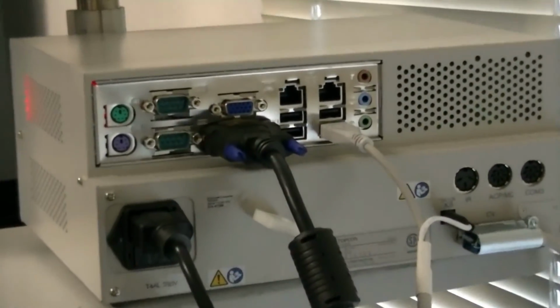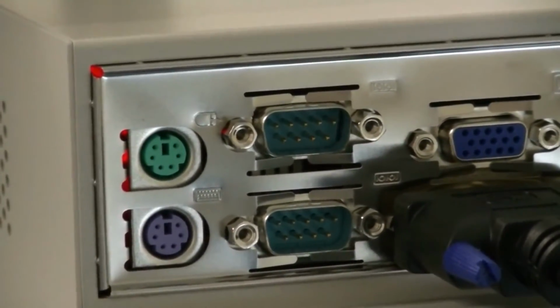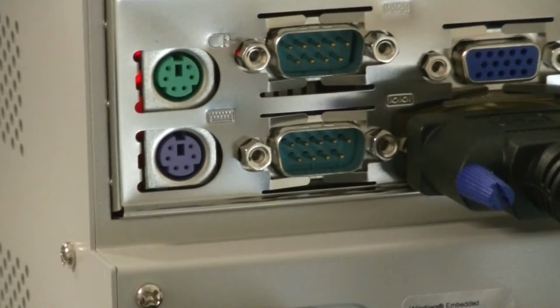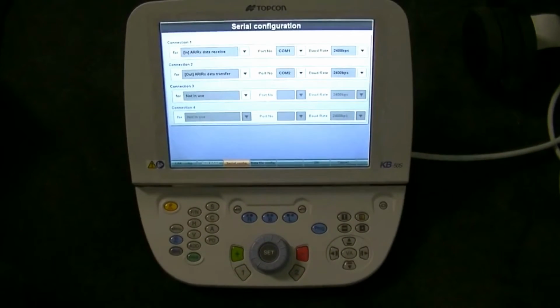Right like that. And we're concerned about those two ports right there. Okay, and those are the ports where you plug in the Bluetooth units. Okay, so I'm going to go back now to the screen. Okay, so we're going to screen back down here. Zoom out.